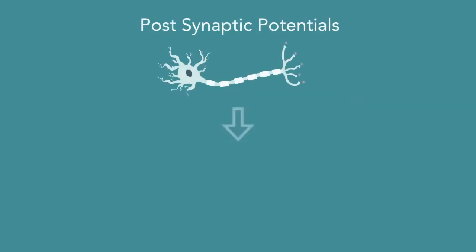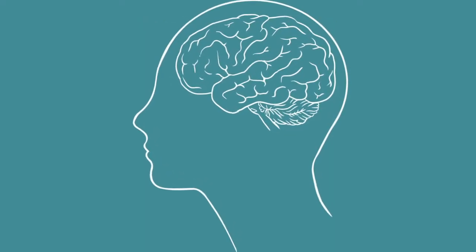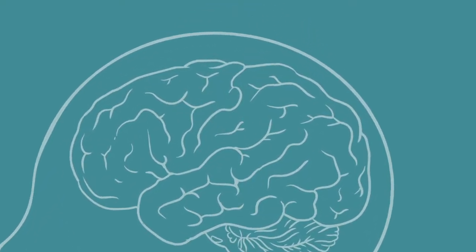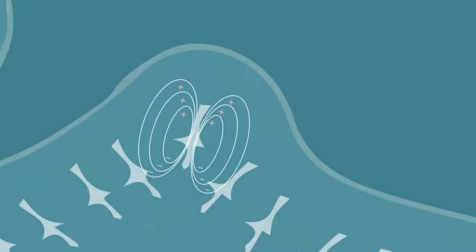In the previous two videos, we discussed how postsynaptic potentials generate dipoles. This electrical activity forms the basis of EEG recordings. In this video, we will walk through how these dipoles are summed together in order to be read by sensors at the scalp. A single dipole, generated by the postsynaptic potentials of a single neuron, is generally too weak for an electrode on the scalp to detect.